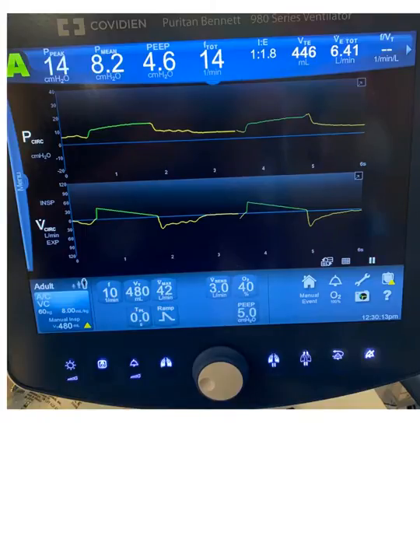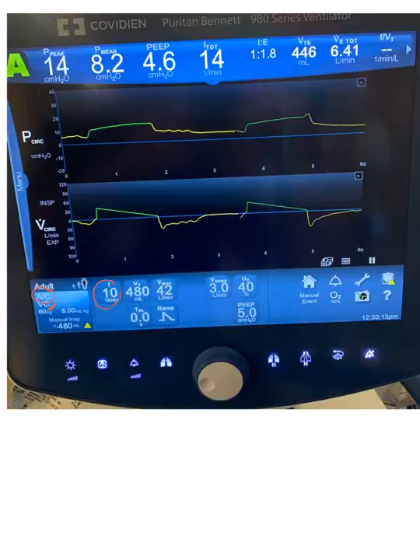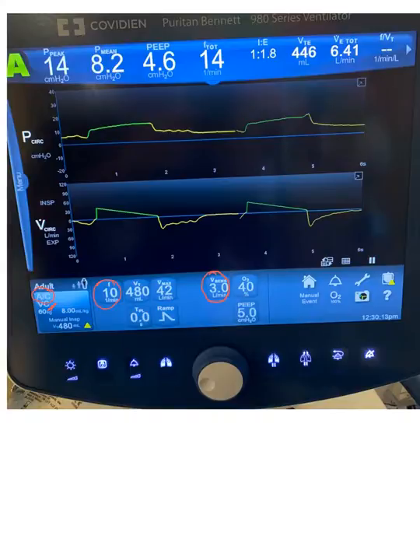Let's demonstrate volume control. As you can see, this is the mode: volume control, labeled VC here. The trigger is by default assist control. We provided a backup rate of 10 per minute — this is the control/backup rate. The patient trigger is a flow trigger, and we provided a flow rate of 42 liters per minute.